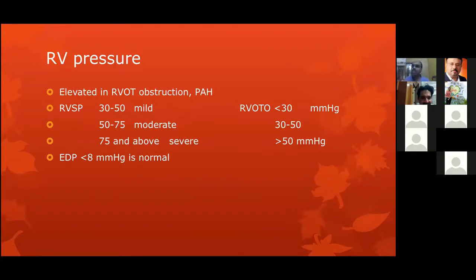RV systolic pressure of echocardiogram and RV systolic pressure of cardiac catheterization will match if the echocardiographic pressure signals are appropriate and adequate. There are lots of fallacies about adequacy of the right ventricular systolic pressure assessment on tricuspid regurgitation, because the tricuspid regurgitation jet may be inadequate, it may be eccentric, or it may not be in alignment with your echo angle of insonation. So considering all these possibilities, RV systolic pressure echo versus RV systolic pressure cath may vary or may be concordant.